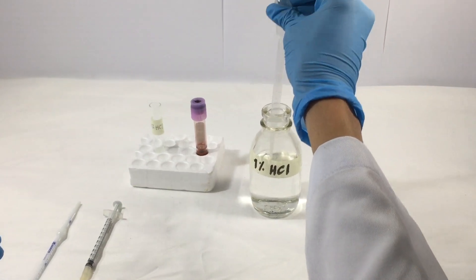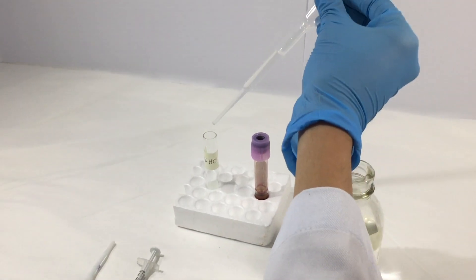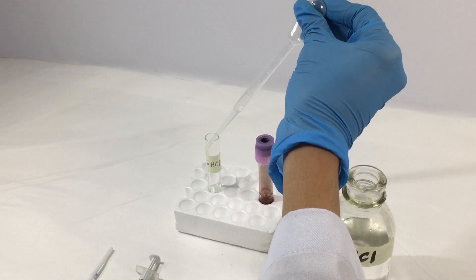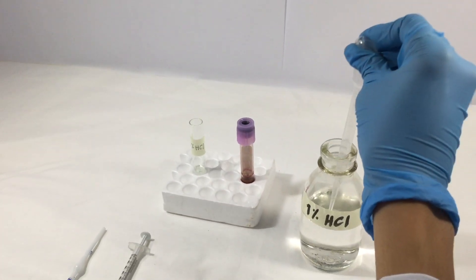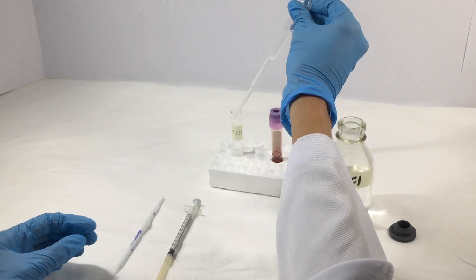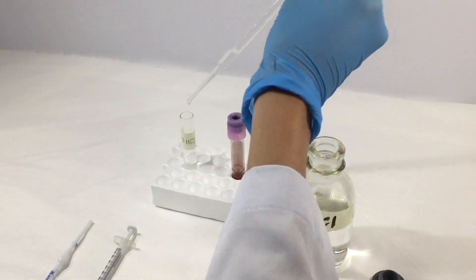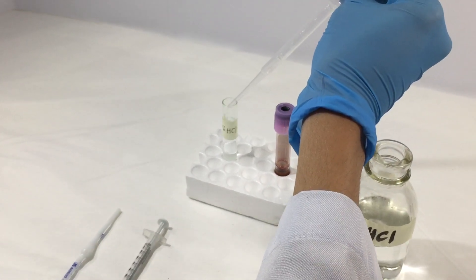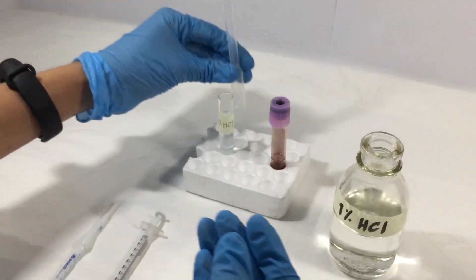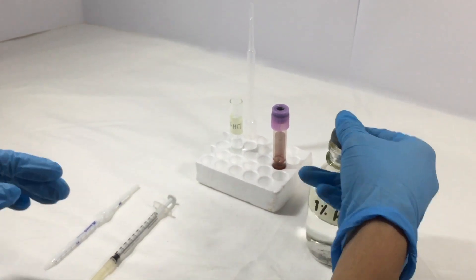First, take 1% hydrochloric acid, or any other diluting fluid suitable for WBCs, and place it in a test tube. Fill up the test tube three-fourths of the way to make it easier for you in the next steps. Don't forget to cap your reagent bottle to avoid contamination.